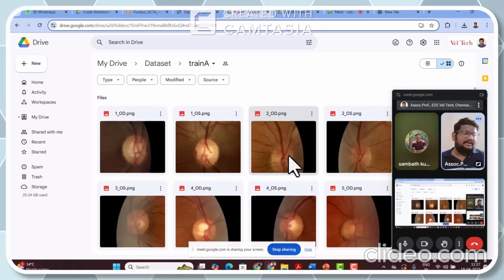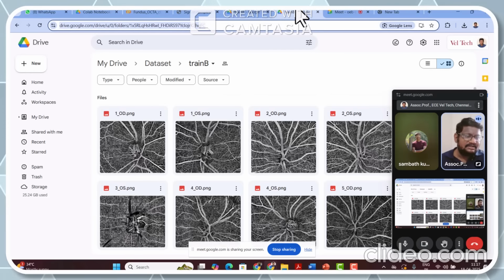Okay. So we are exploiting the computational power of generative AI, where we are training generative adversarial networks with OCTA and fundus paired images, and we are trying to synthesize OCTA images for newly acquired fundus images. So that is what our project is. We know the power of generative AI. With it, instead of generating specific images, we are trying to generate paired images. Not exactly generating paired images: if we give one modality, we should be able to generate another modality.